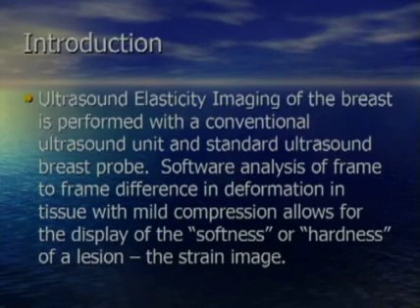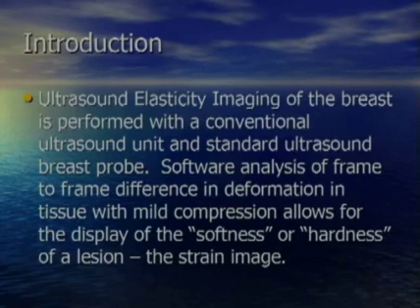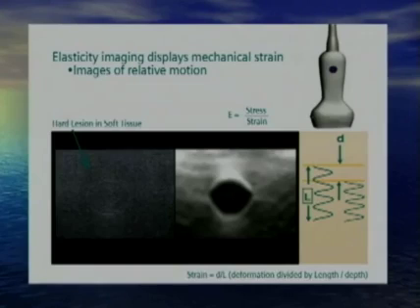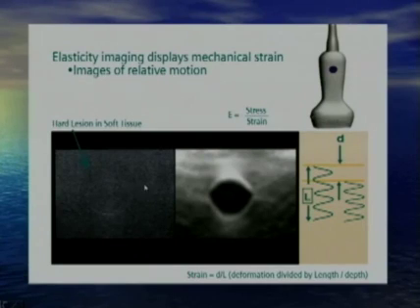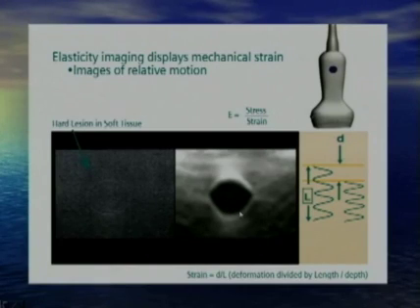Elasticity imaging of the breast is performed with a conventional ultrasound unit and standard breast probes. Software analysis of frame-to-frame differences and deformation of the tissue with mild compression allows display of stiffness — the strain image. Here the B-mode image shows a lesion that is isoechoic to the surrounding background, so it's not very conspicuous. However, with displacement elastography, the lesion is clearly visible because it shows up as hard compared to the soft background.